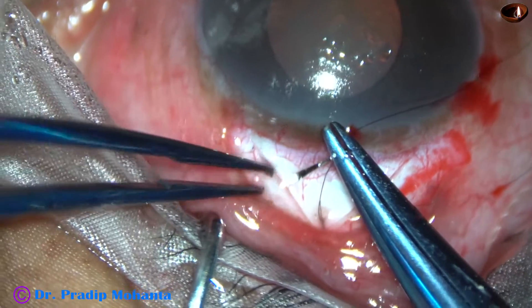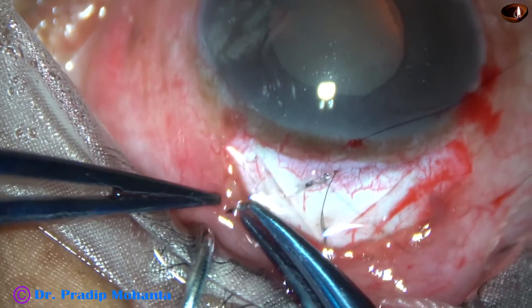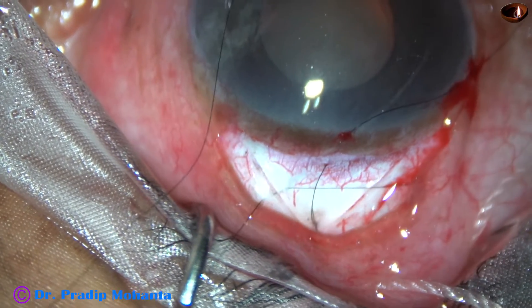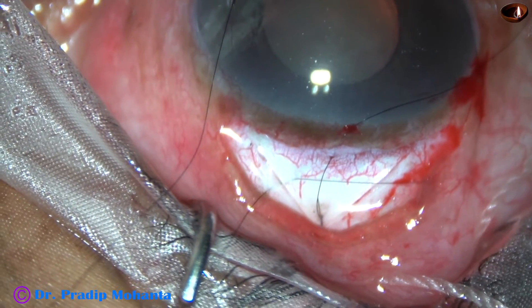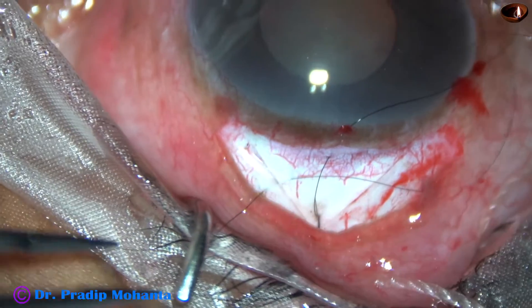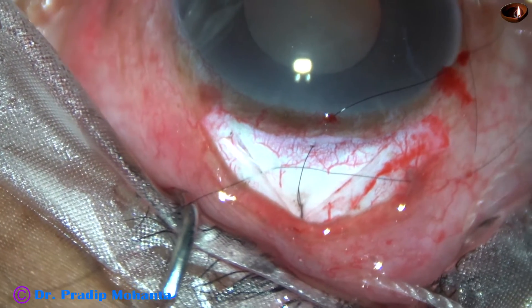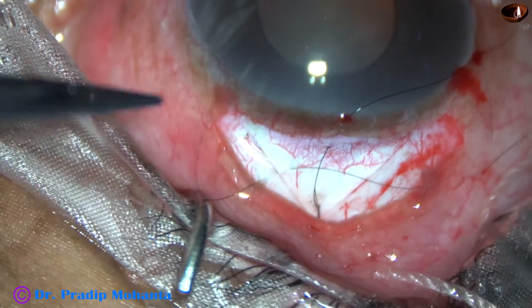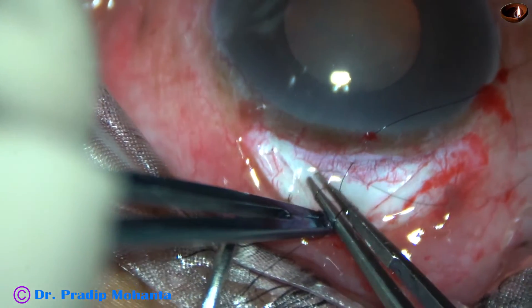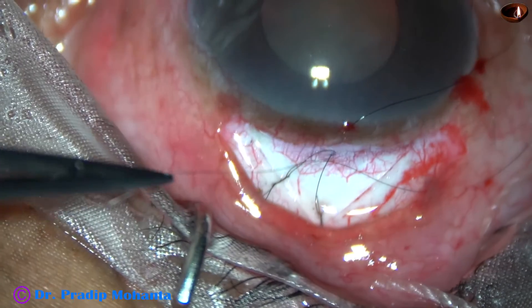This is another releasable suture on the left arm of the triangular scleral flap. A portion of the suture is outside the conjunctiva — from outside the conjunctiva it comes inside. Bites are taken across the scleral flap. And this is another releasable suture.